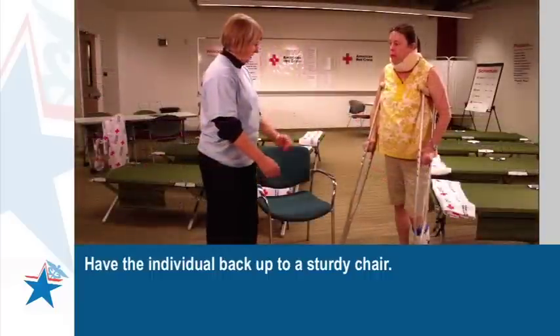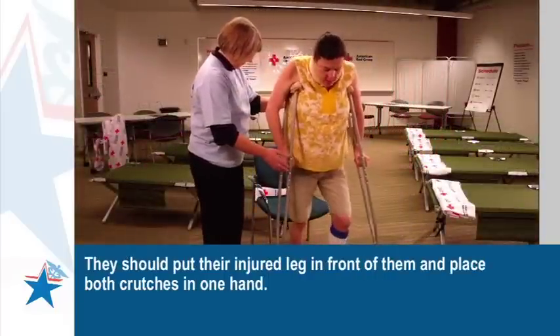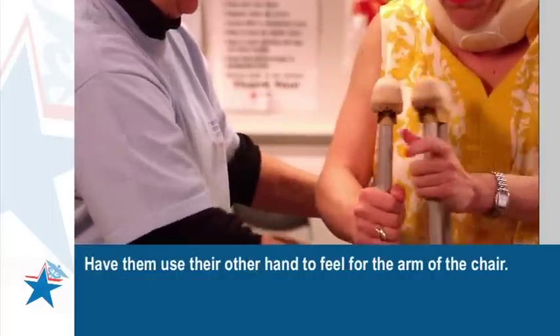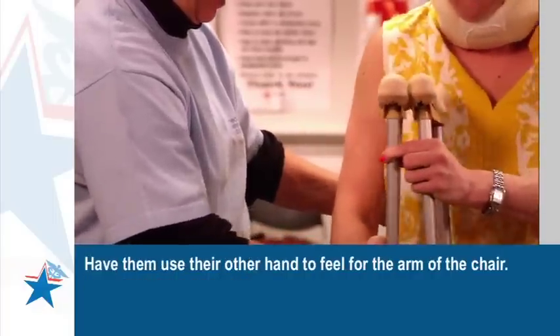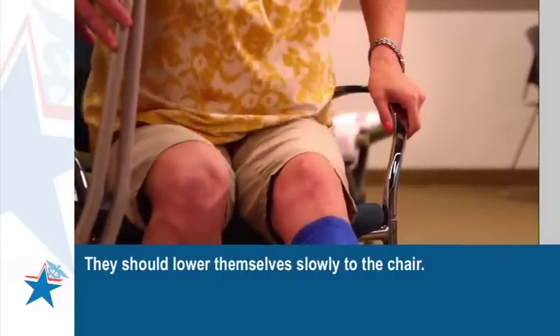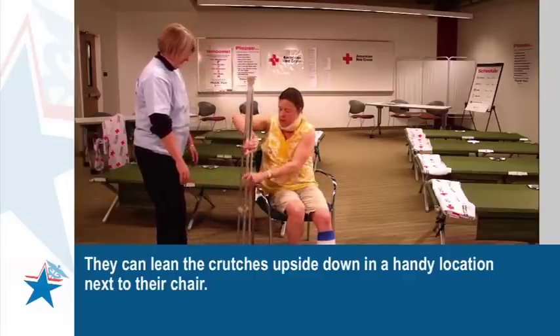Have the individual back up to a sturdy chair. They should put their injured leg in front of them and place both crutches in one hand. Have them use their other hand to feel for the arm of the chair. They should lower themselves slowly to the chair. They can lean the crutches upside down in a handy location next to their chair.